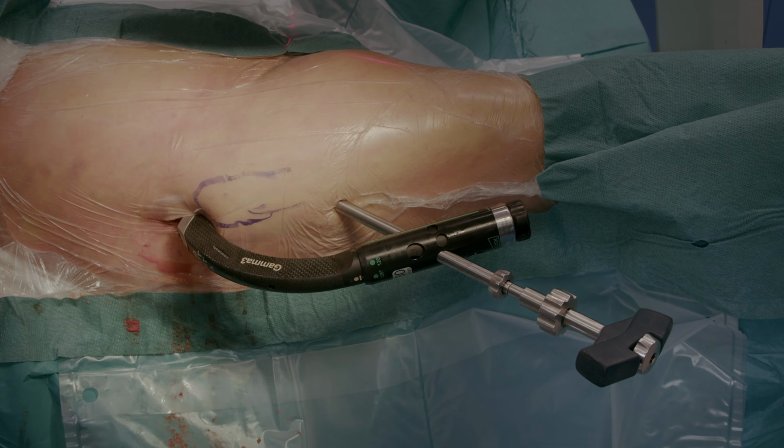It must be noted that in case of a basal femoral neck fracture, dislocation of the fracture may occur from the base of the femoral neck when screwing the lag screw. In order to prevent this, you can insert another wire to serve as an anti-rotation wire, thereby first fixing the fracture in place. This risk is in particular in the insertion of the lag screw into the left hip, less so in the right hip. This is due to the difference in direction of the screw rotation relative to the fracture.